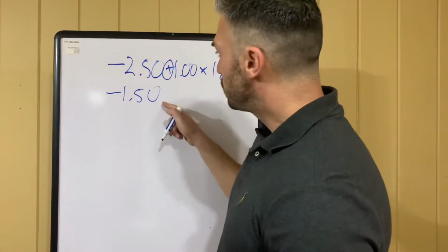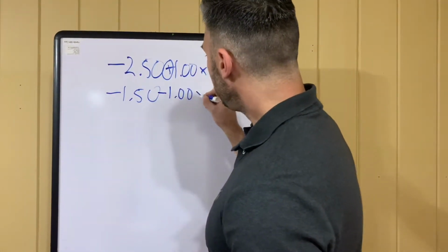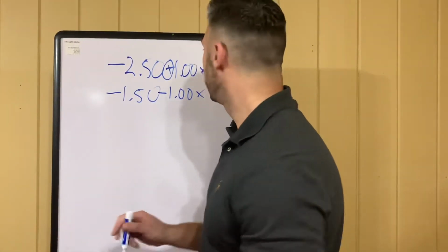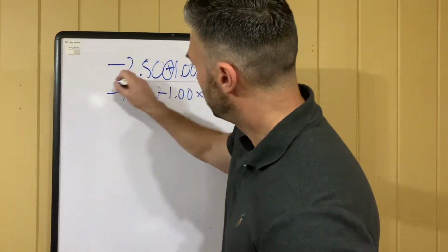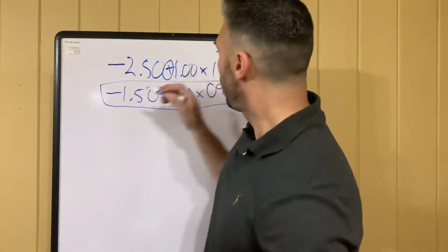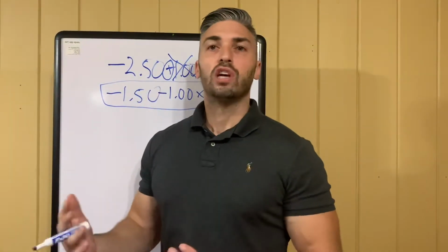You're going to change the sign of the cylinder and just drop it down. Then the last thing to remember is to rotate the axis 90 degrees. So 180 here would become axis 90. Right, that's a lot prettier for us to work with. We don't want to work with that plus cylinder. So that's the first step when you're looking at these equations.